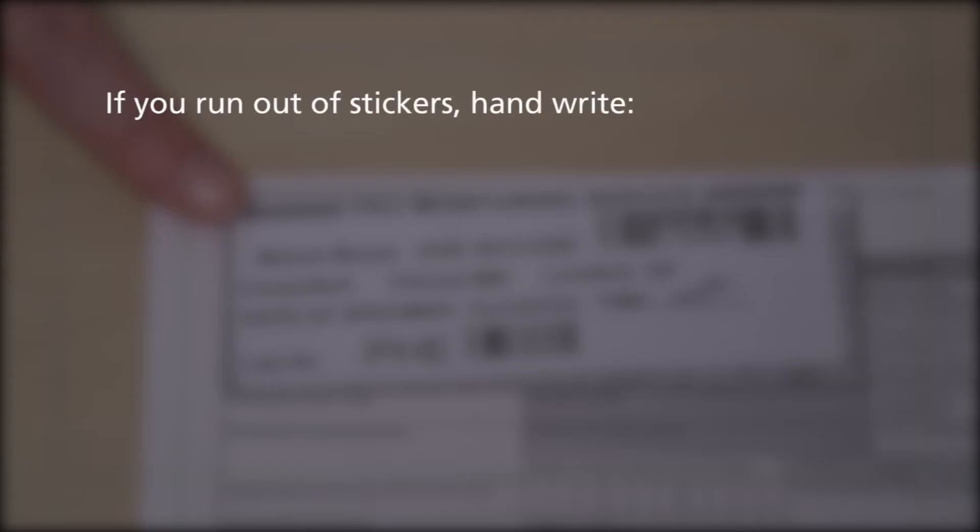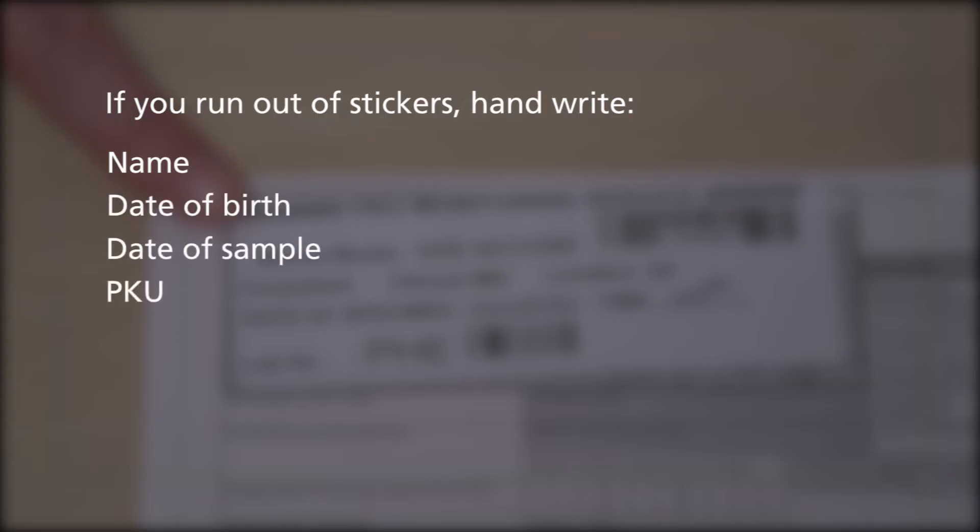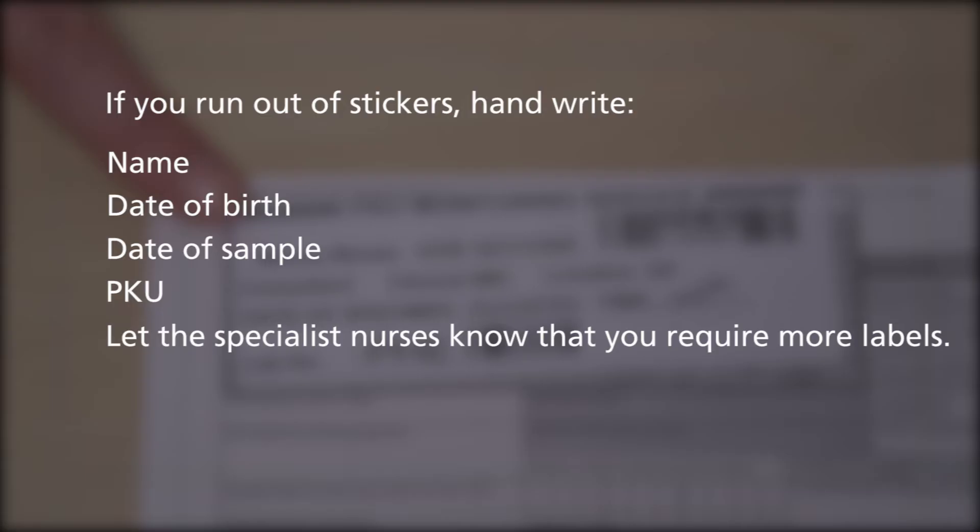If you run out of stickers, then handwrite on the name, date of birth, date of sample, and PKU, and let the specialist nurses know that you require more labels.